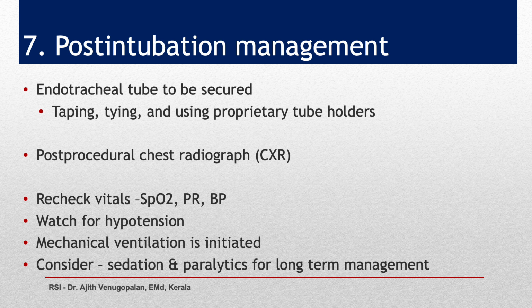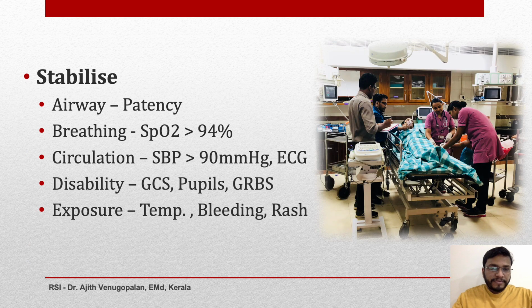You stabilize the patient, make sure you have done the intubation. Our case to begin with was an airway compromised with hypoxia and hyperventilation. Now you have intubated the patient, you have made sure that the patency is maintained, and that saturation is maintained above 94. You have to have proper ventilator settings adequate for the patient. Ventilator setting is also out of the scope of this session, and can be considered as another session. The ventilator settings are properly done to make sure that the patient is maintaining a proper tidal volume as required for the condition.